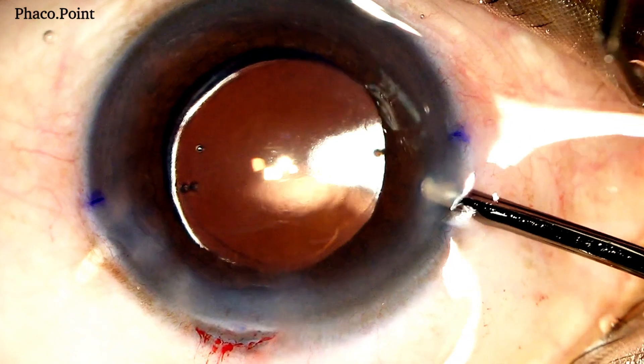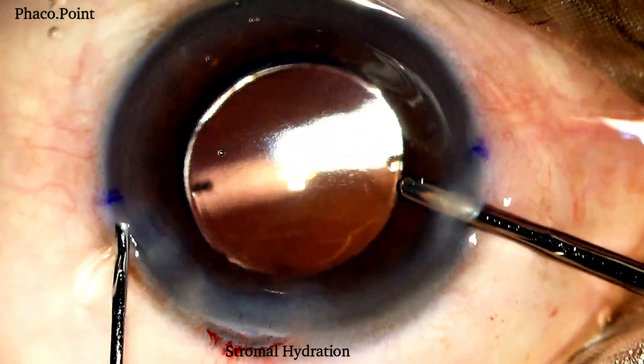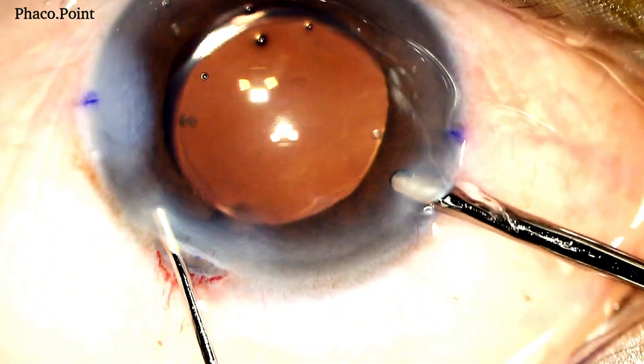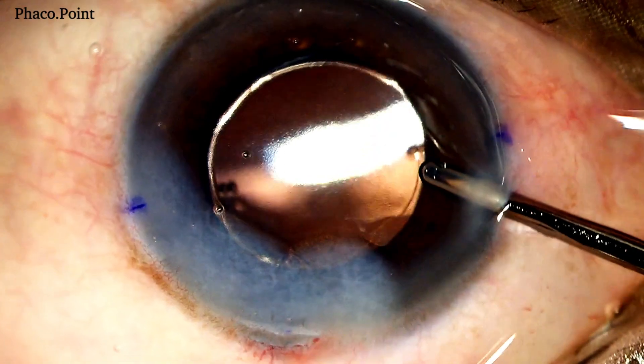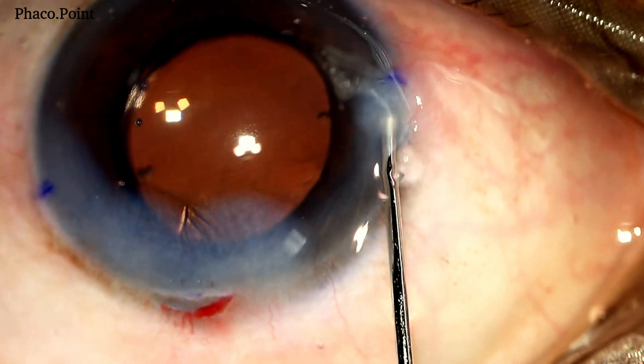Whilst leaving the irrigation still in the eye, I now proceed to hydrate the wounds. Care and caution is taken even while performing this step, because excessive force while doing so could result in a rotation of the IOL. So whilst I perform the stromal hydration, I ensure that I maintain the alignment previously achieved.